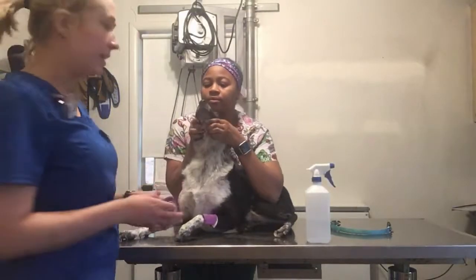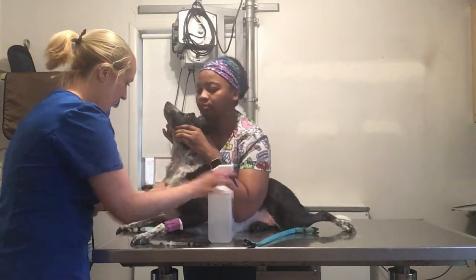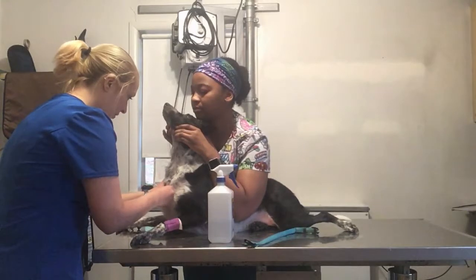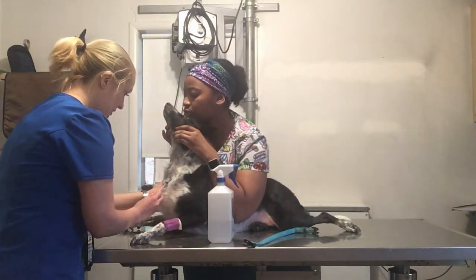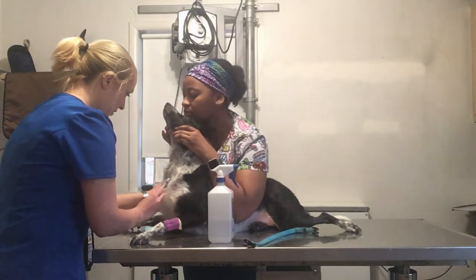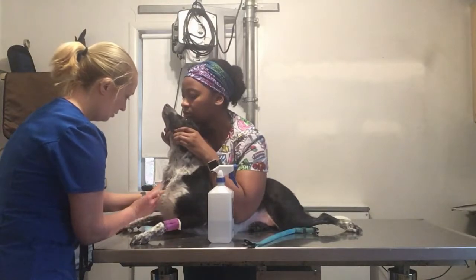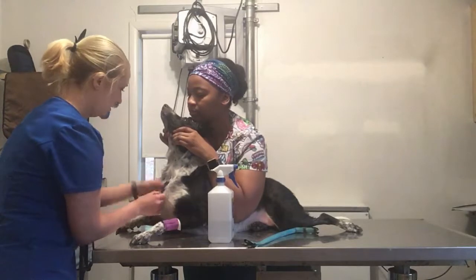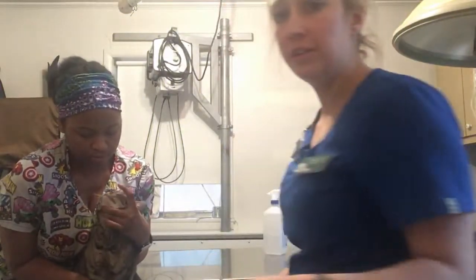Okay, this is going to be the canine jugular draw. So we're going to be doing the jugular for the cat.